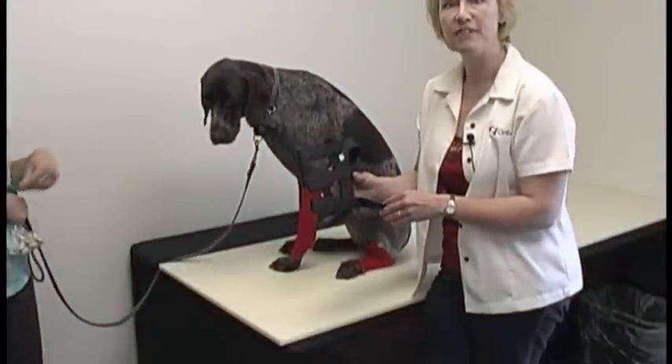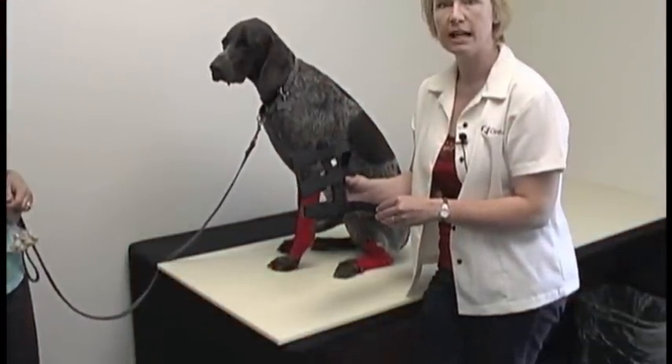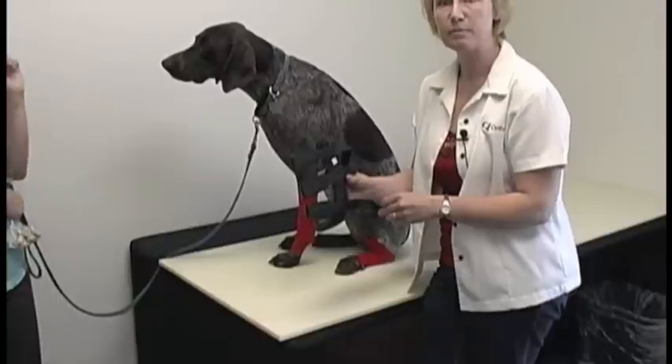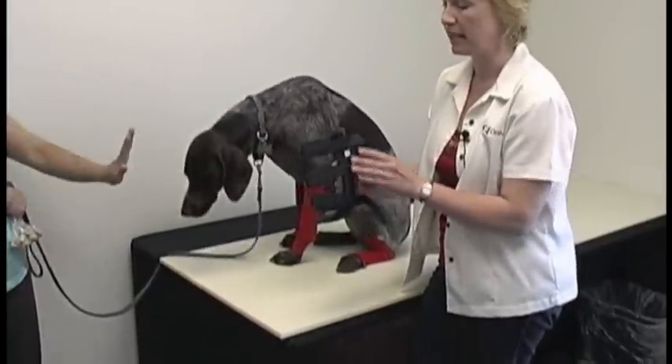Hello. Welcome to our fitting portion of an OrthoVet training video. I'm going to show you today how to fit a splint, and first we're going to prep the splint and get it ready for the fitting.